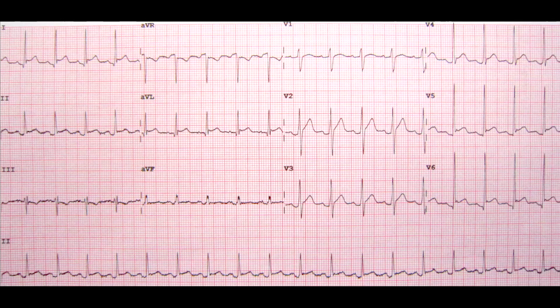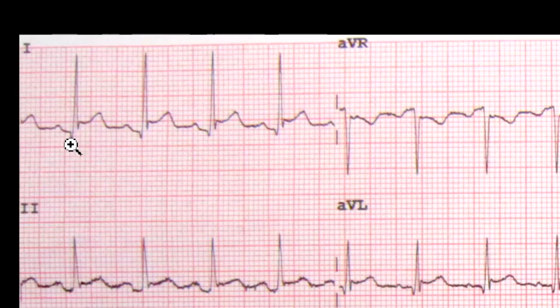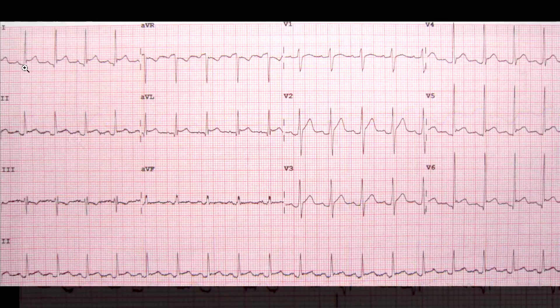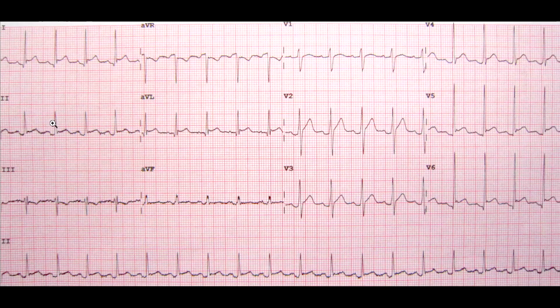Something that may look similar, because it can also cause chest pain and ST segment elevation, is something called pericarditis. This is an ECG of somebody with pericarditis, and you can see we also have ST segment elevation — notice that this bar here is higher than this bar. We see it here in lead one, lead two, AVL, and also to some degree in the lateral leads: V4, V5, V6.